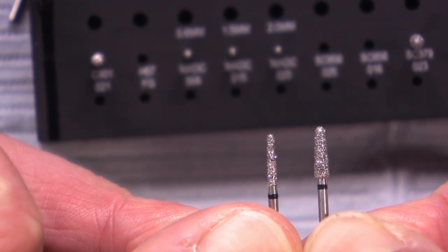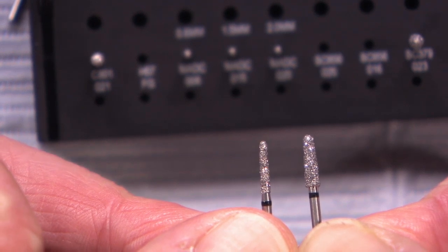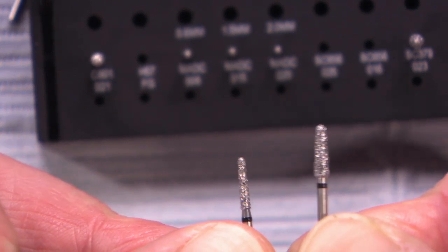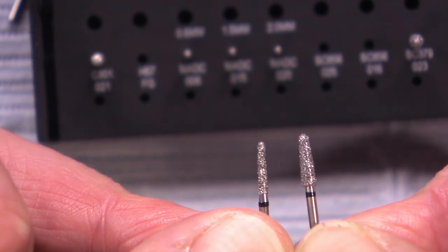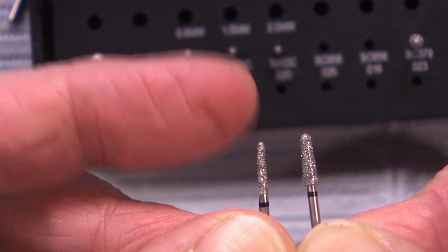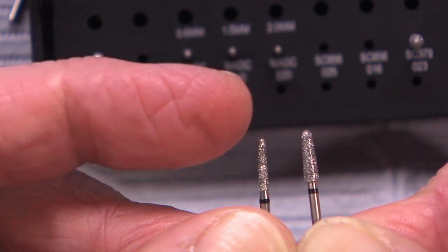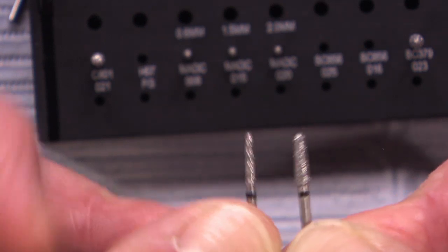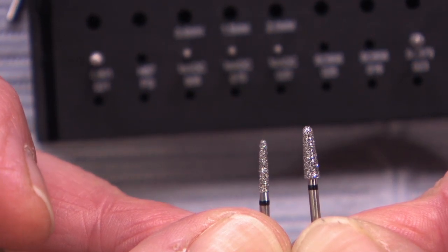So the one on the left, the 016, the skinnier burr, is the one that we use interproximally so we don't bump the adjacent tooth when there's not room to go in with the 025 yet. It just depends on the teeth and the contours of the teeth, but oftentimes I'll go in on anterior teeth with the 016 first, and once I've gone through there once or twice interproximally with this burr, then I'm able to use the big one, which has the shape that I like at the tip and really gives us a nice finish line.